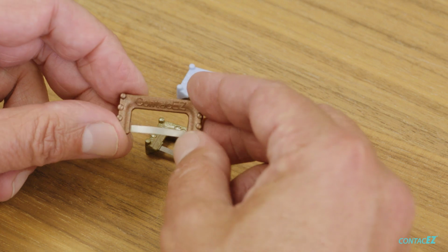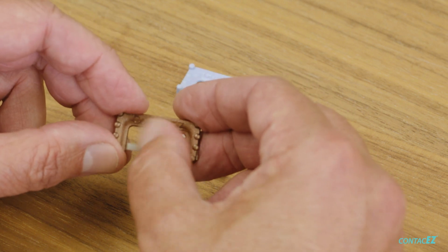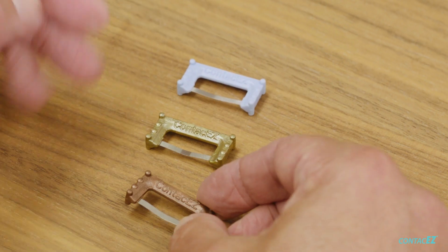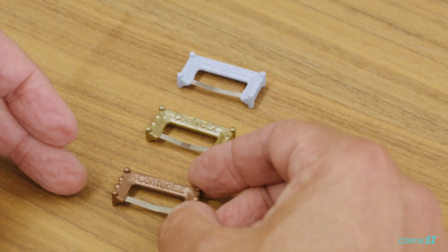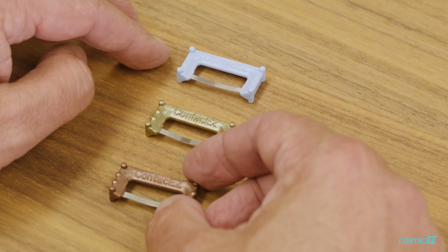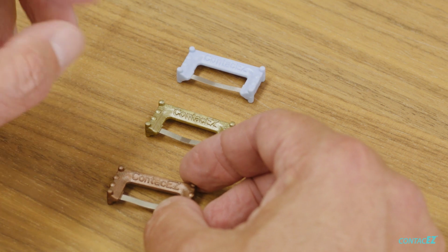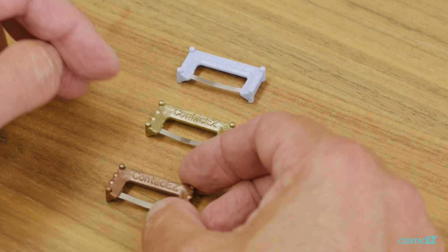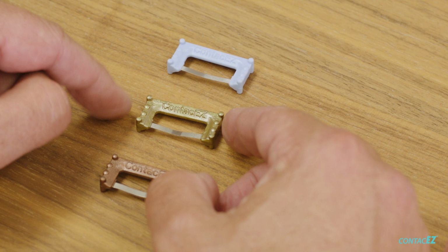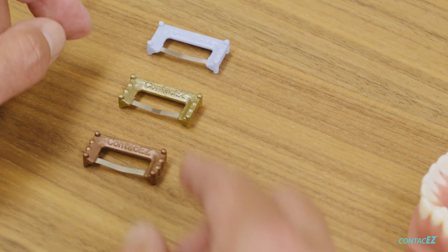And then we have this copper narrow strip, and it's single-sided with a fine diamond, and this is how we're going to polish the restoration. So it's basically cut, trim, polish when you look at these. For the large protruding overhangs, we're going to start with the blue strip and then work our way down. And if it's not a protruding overhang, if it just needs to be reshaped, then we can go right to the trim with the gold strip and skip the blue cutting strip.